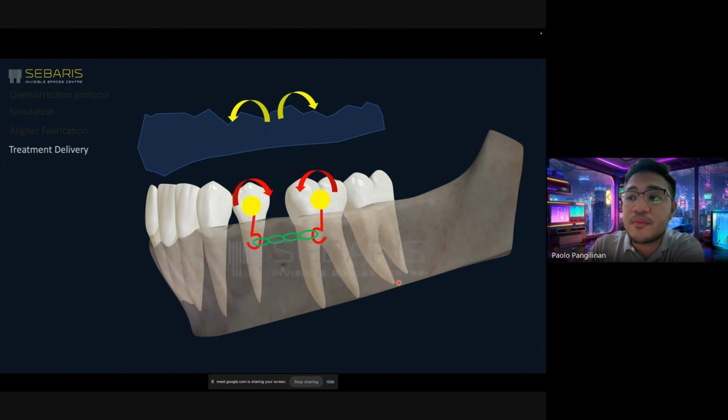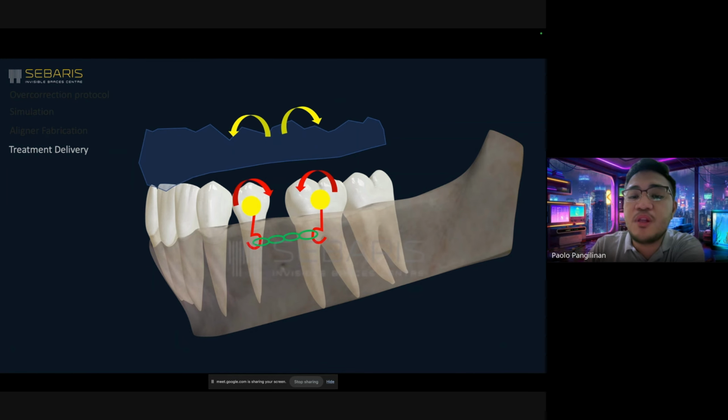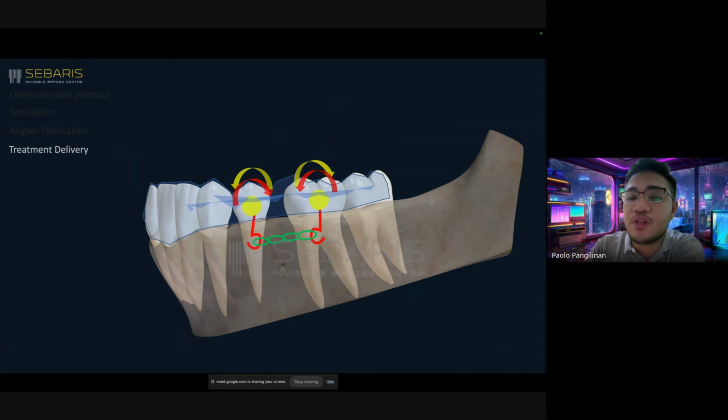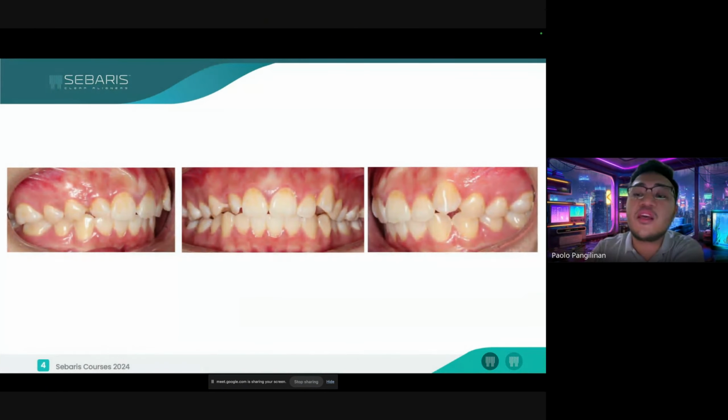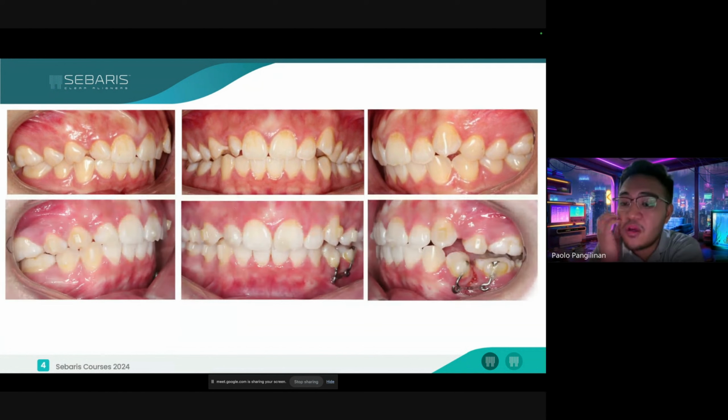Once we program your aligners, we're gonna place the power arms. And from the power arms, basically, we're going to pull them out like this. Rotation movements are canceled out. We use the power arms to elicit the pull, and the aligners are basically assisting the whole thing. And the power arms are placed closer to your center of resistance to reduce the amount of moments that we're going to have. So the idea here is, from this aspect, now we're closing it.